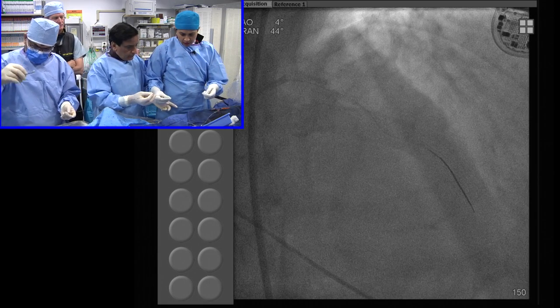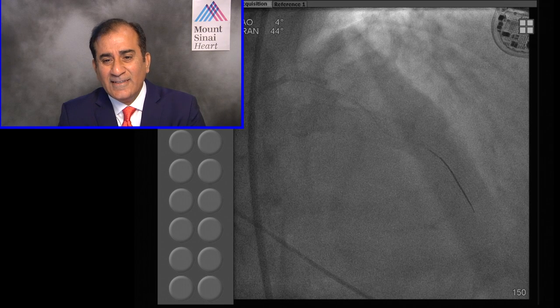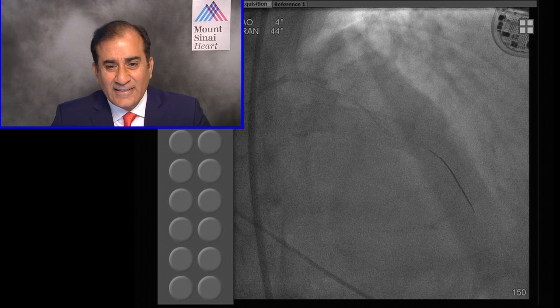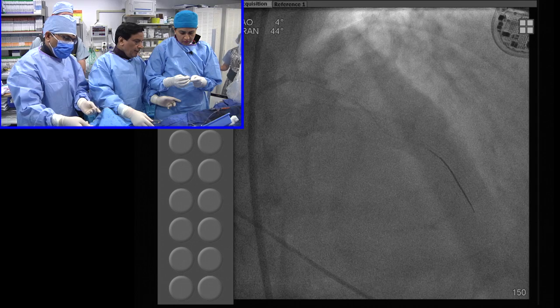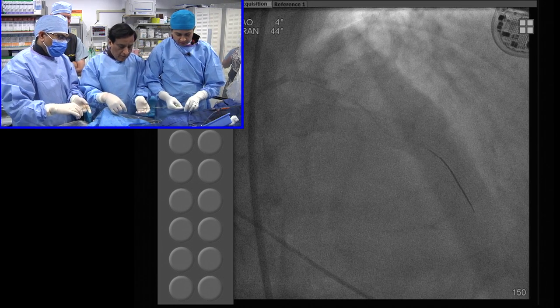Here, Chuck, we were demonstrating. All the focus was on BVS, and maybe we go on the run through. Challenges with the diagonal, we knew about this diagonal. I mean, that's why the whole purpose was to make a complex case.